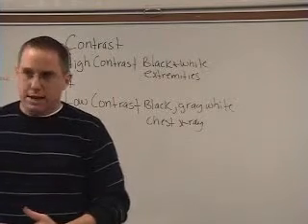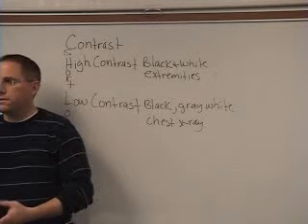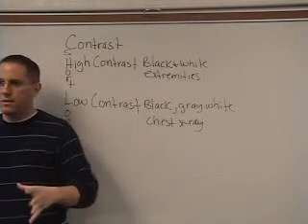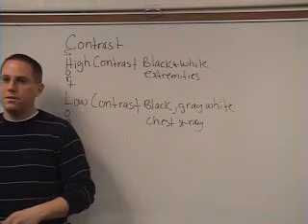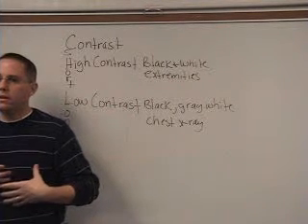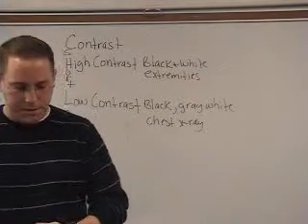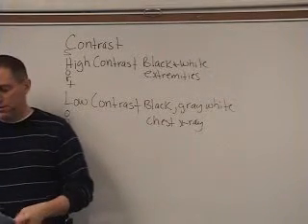Also, if you have the x-ray tube too close to the patient, what do you think that's going to do? Is it going to make the bones look larger or smaller? Larger. If the tube gets too close, it magnifies the bone. If you're doing a chest x-ray and the x-ray tube is too close to the chest, it can make the structures in the chest look larger. Like maybe the heart will look larger than it is. It's because you're magnifying it. So you have to remember to make sure your distance is correct so that you don't change how big or how small it is. That's called the geometric properties.